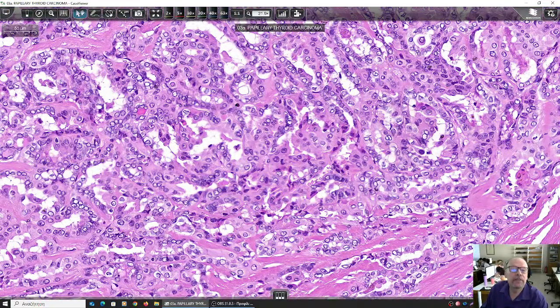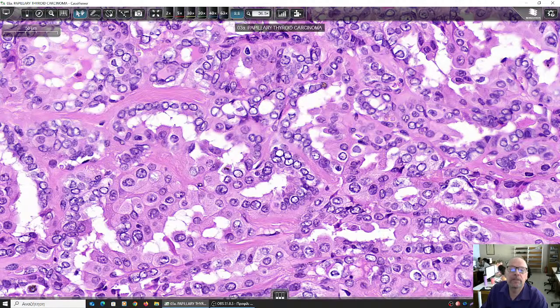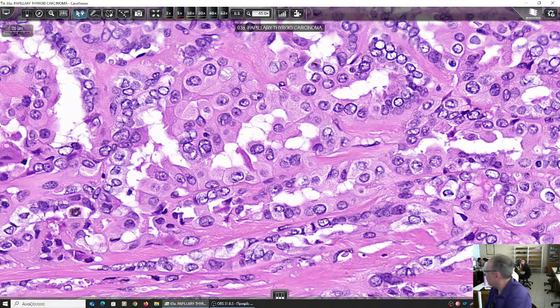Can we see those? I'm not sure that we can see them. Oh no, I think I saw one. Well, here it is. Oh, where was it? I missed it. Oh, no, I dreamt of seeing one, sorry. Oh, yes, I saw one. Here it is.